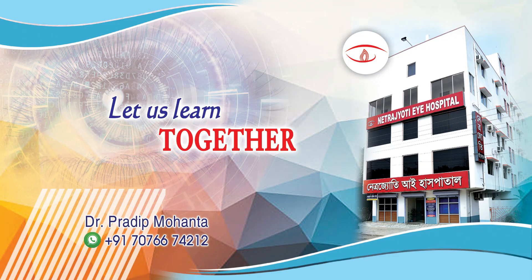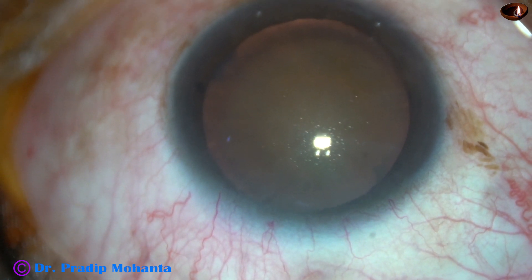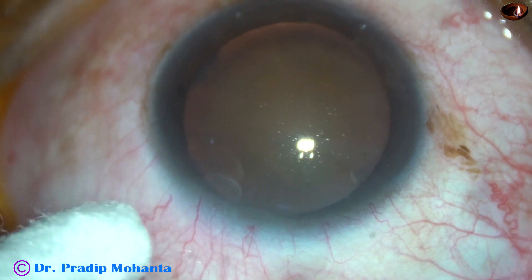Friends, welcome to my workplace at Ranaghat, West Bengal, India. In this video, I am going to demonstrate the divide and conquer technique of phacoemulsification.